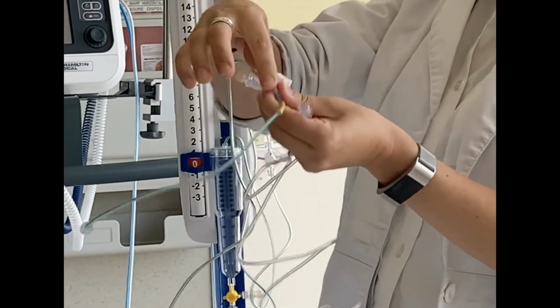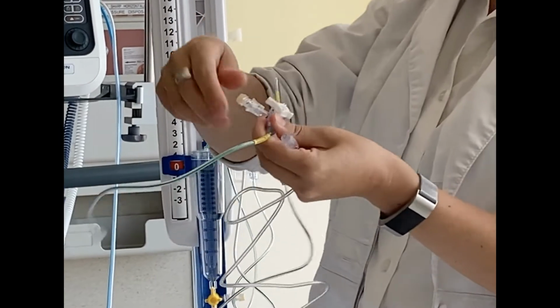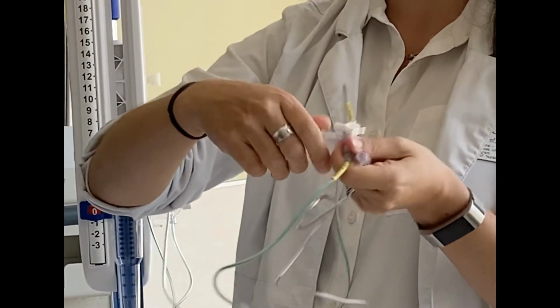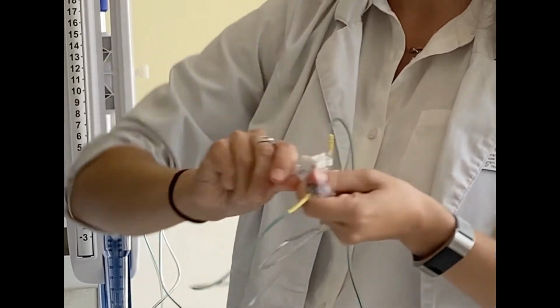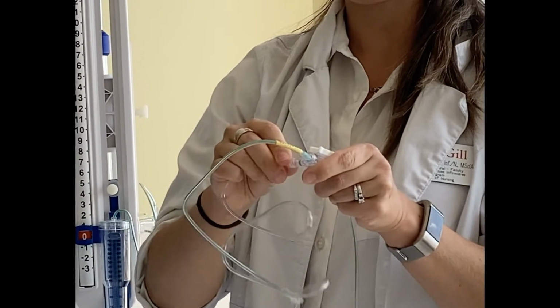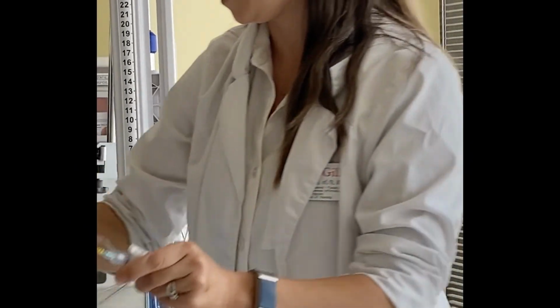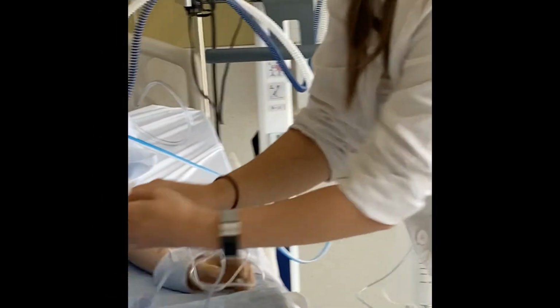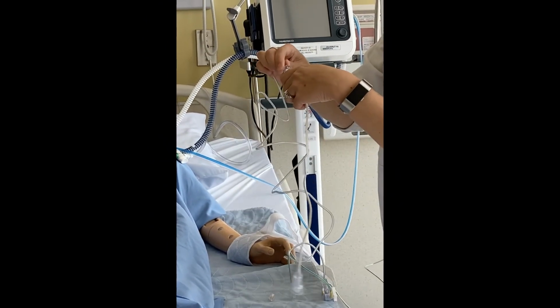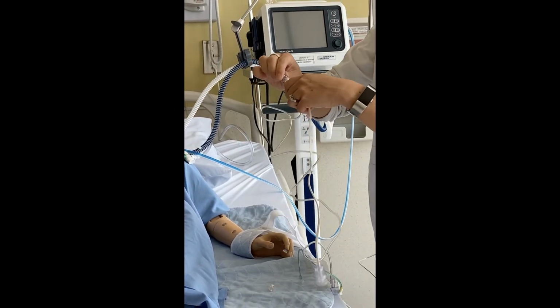So this is where my CSF measurement line originates. Because this is a 3-way stopcock, I can take off this cap, connect my pressure tubing here, and then connect it directly to the transducer. Of course, all of this would be primed with sterile saline with no preservatives.